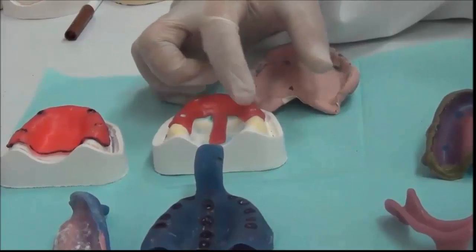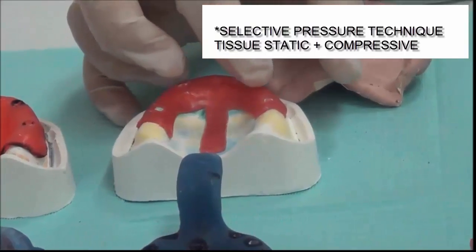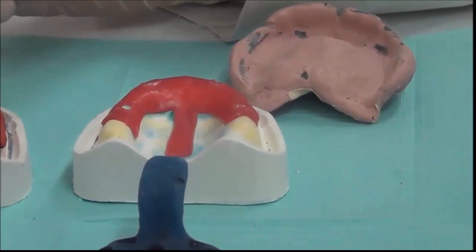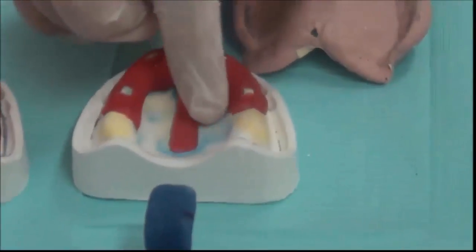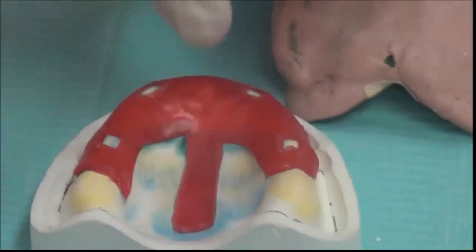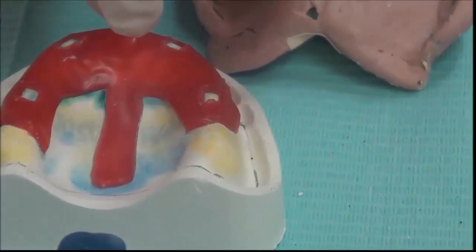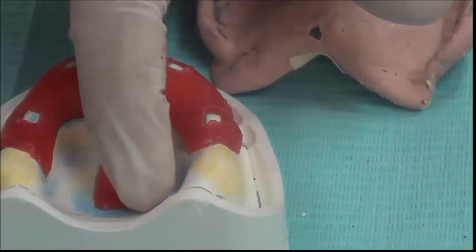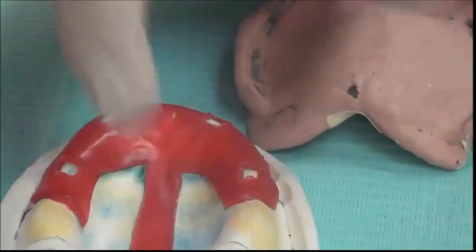What about partial spacer? Partial spacer means that I'm placing the spacer in areas we call relief areas, areas that we should not exert pressure on for many reasons. While the areas without any spacer will have the tray closely fit to the tissue. So in these areas, the impression material will be squeezed between the surface of that soft tissue and the tray. So this area will be firmly compressed. These areas are firmly compressed, and these are called support areas.